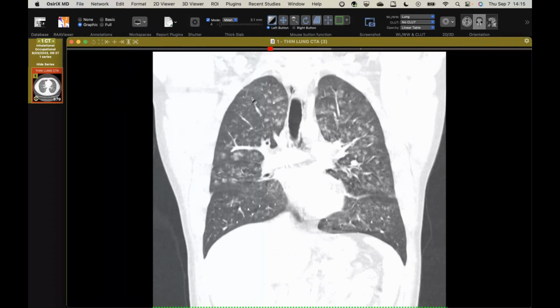Yeah, but eventually it looked to me as if the diffuse lung disease ended up being worse than the bases in many cases. Am I just remembering incorrectly? I mean, most of the cases looked like your typical organizing pneumonia, and they were kind of wherever they wanted to be, more like COVID. But the ones with the centrilobular patterns seemed to be, as Travis said, more mid upper lung. I think originally we referred to it as HP-like, but it turns out it's really OP, centered on the airway. David, you're right. The more traditional run-of-the-mill organizing pneumonia or acute lung injury (DAD) cases were lower lung or diffuse.